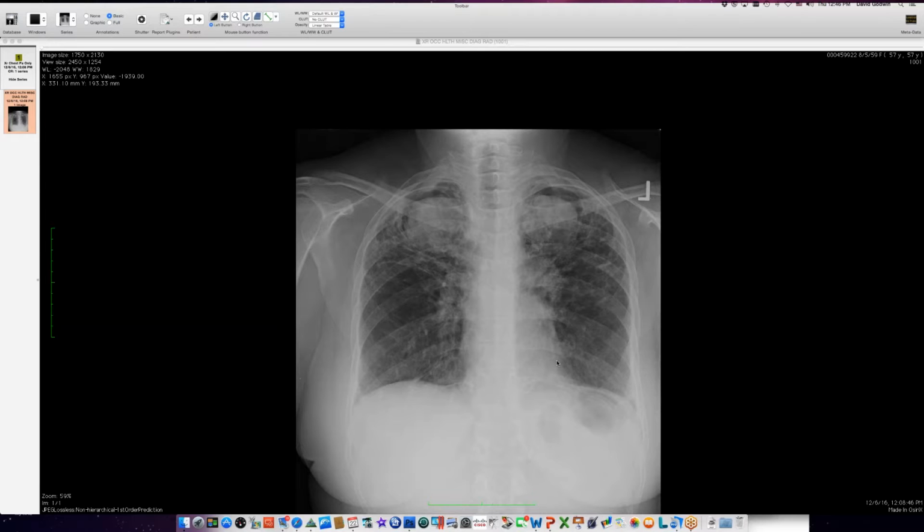Great. Jeff, did you see stuff like this in Cleveland? Because Tom had sent me cases from Cleveland that look probably like the same cases. Probably the same cases because we overlapped for 3 years. Yeah, I mean, we see sarcoid here, but I have one case with bilateral aspergillomas, but these are quite large. But I agree with you. This doesn't look like pneumoconiosis. Right. Great. Lovely.